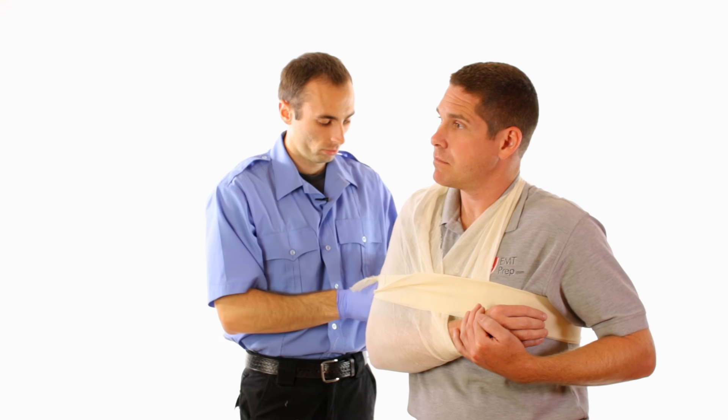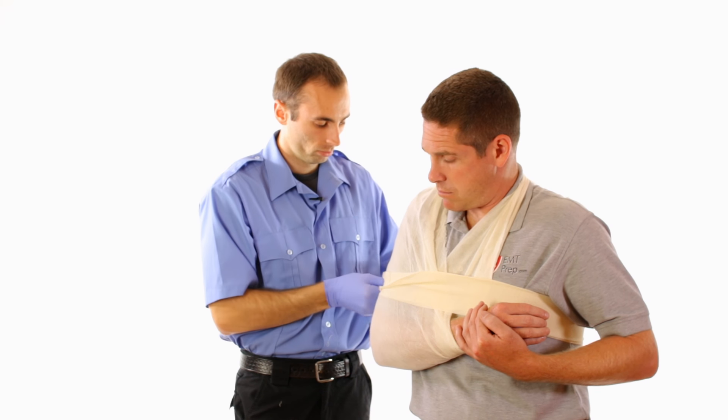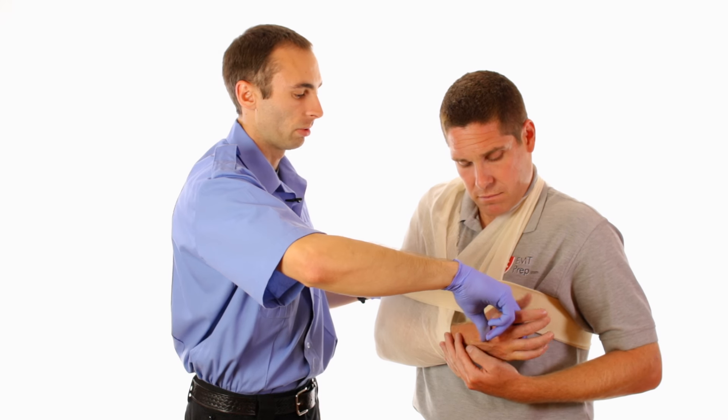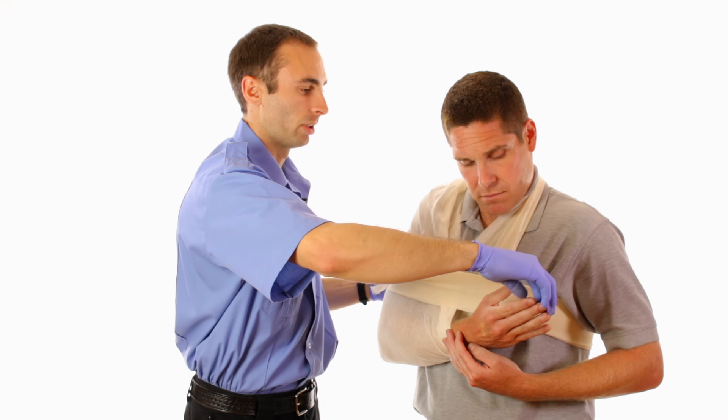Lastly, tie the swath snugly around the body to maintain the immobilized extremity in place and recheck circulation, motor ability, and sensation. Can you squeeze my fingers? Can you feel me touching your fingers?